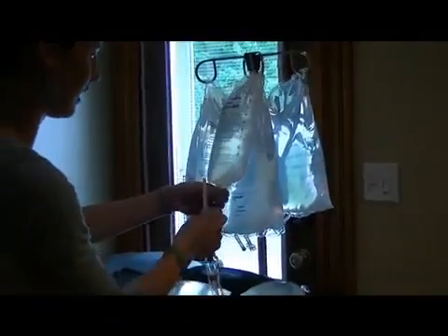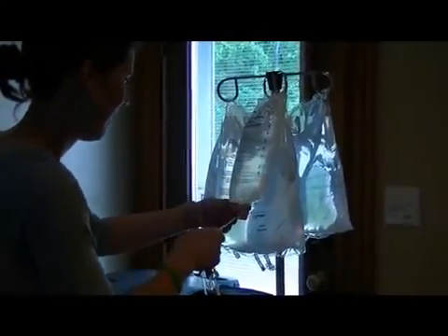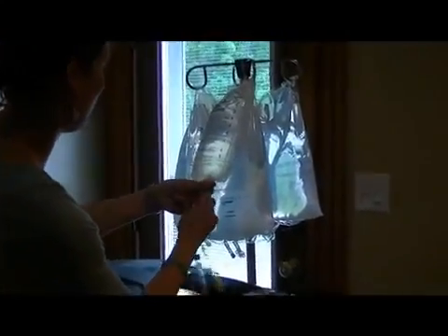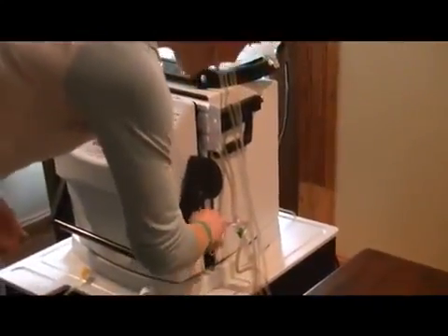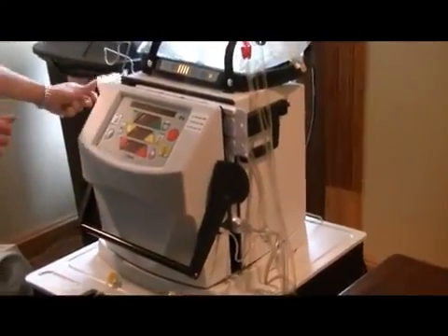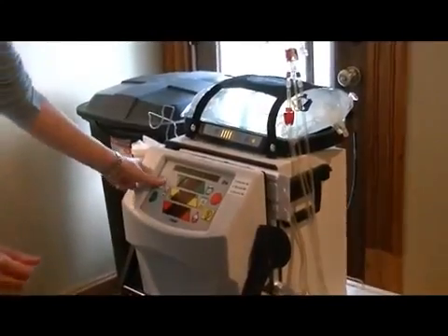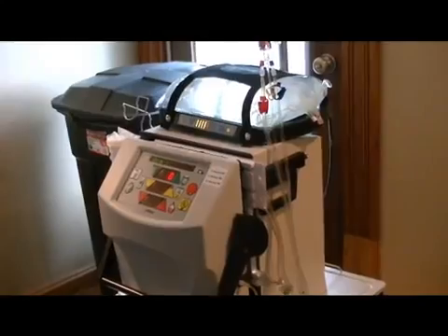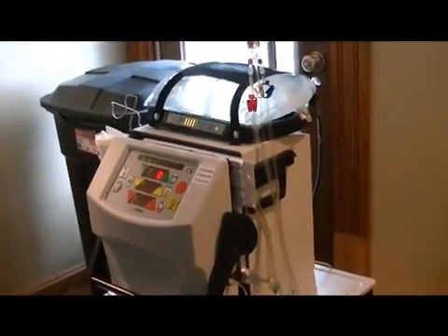And you spike the saline. Okay. Once you get it spiked, then you hook up this. It's called the access pressure pod. And you press the button, and you have to wait 18 minutes where it runs through and cycles through the machine before we start.